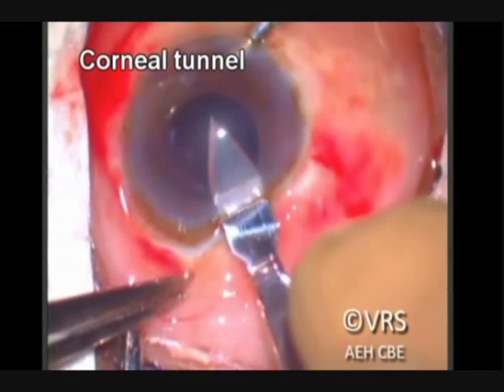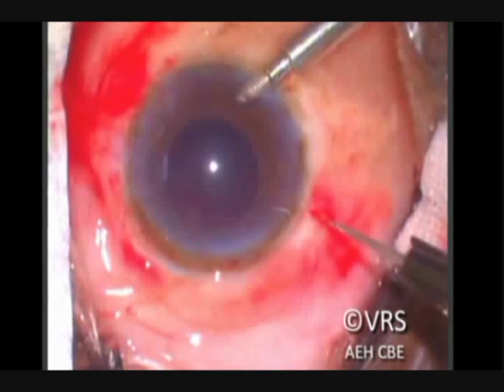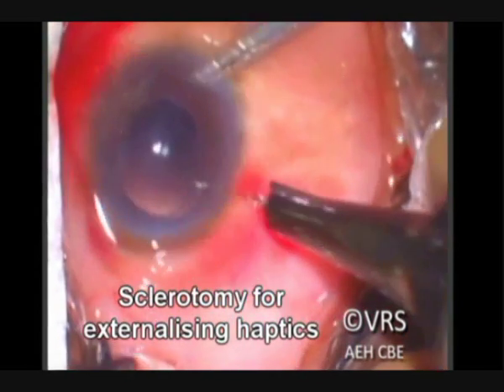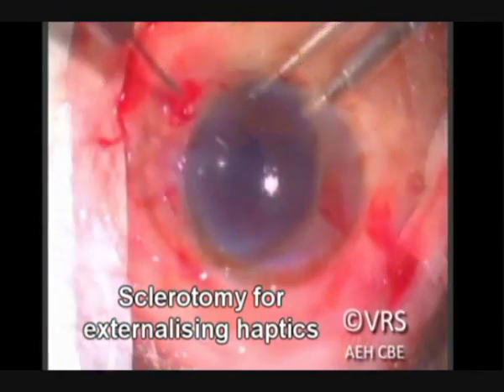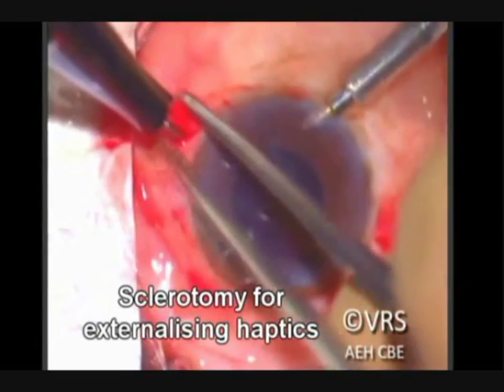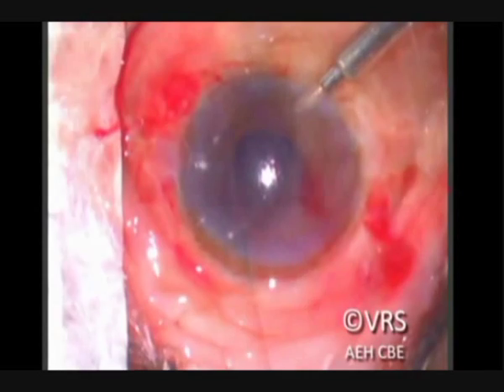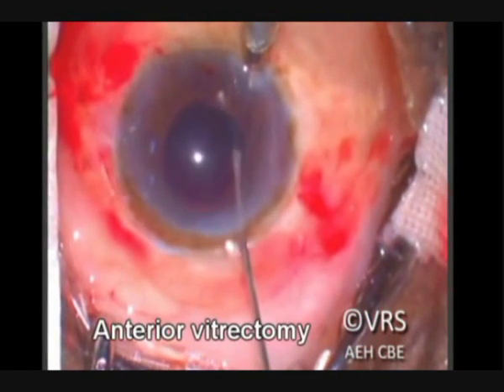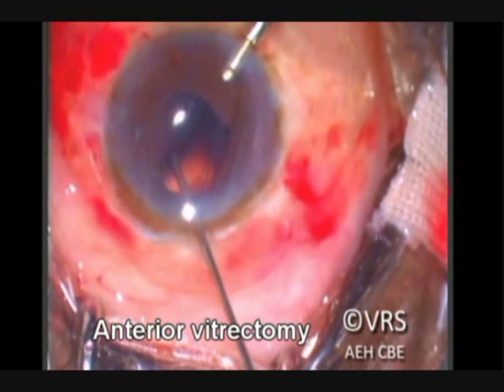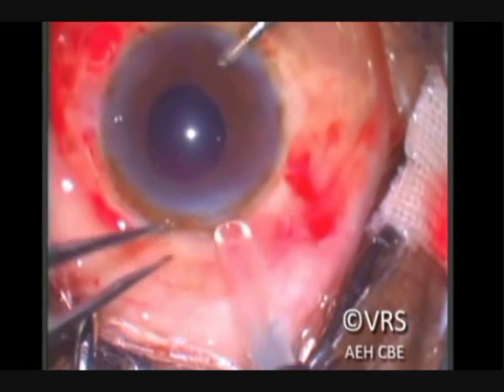Either using a 24 gauge intramuscular needle, or in this case a 25 gauge trocar blade used for MIVS surgery, a sclerotomy is made approximately 1 to 1.5 mm from the limbus at the ridge which was made earlier. A proper vitrectomy is essential, and the loaded foldable IOL is then injected into the anterior chamber.